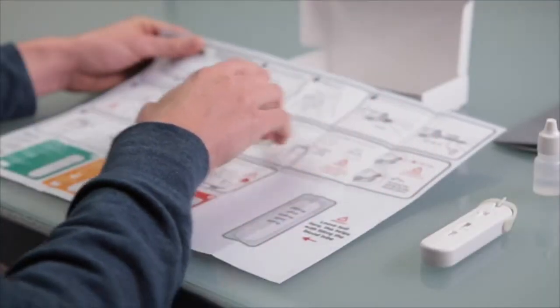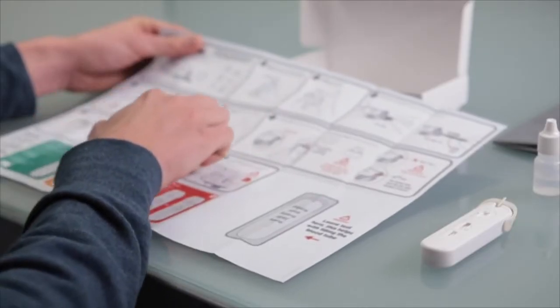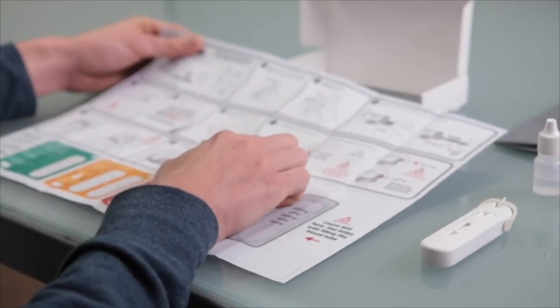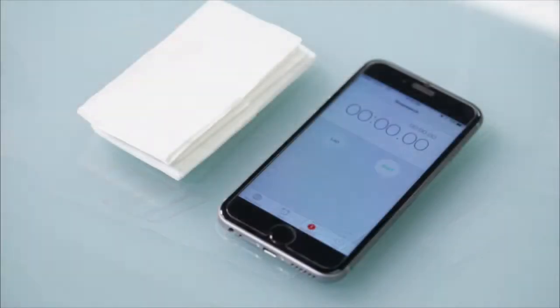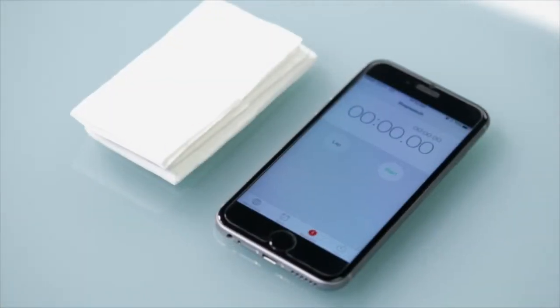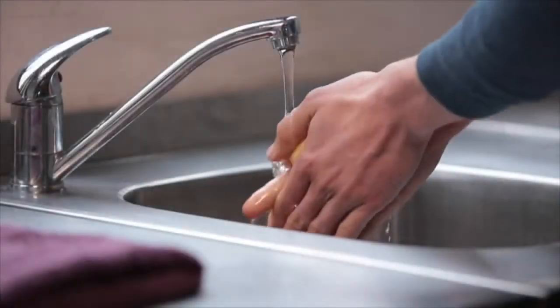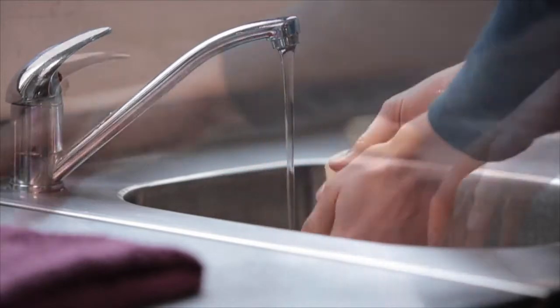Before you start the test, unfold the instructions and read them carefully to get familiar with the testing process. You will need a timer and something with which to wipe your finger at the end of the test. Now wash and dry your hands to make sure they are clean.